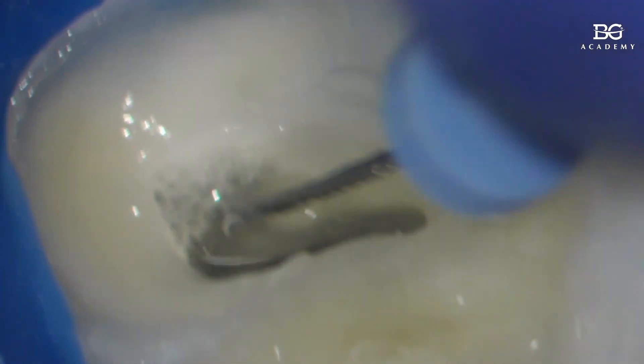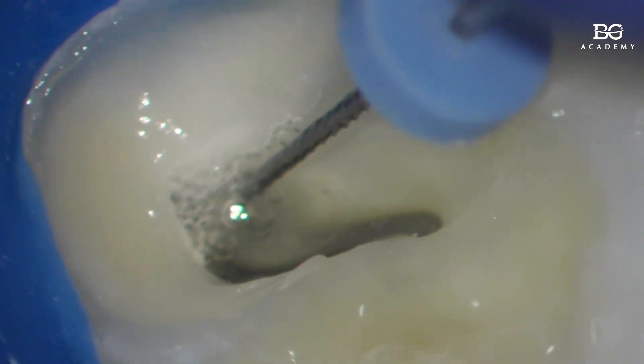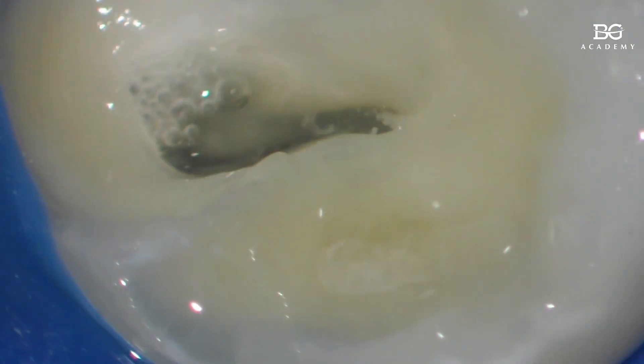Even if it's a size 10 or 8, it doesn't matter. A standard file has a 2% taper, meaning the diameter increases by 2% from the tip to the handle. So if it's a size 10, after one millimeter it's already a size 12, and after another millimeter it's already a size 14. Right there — we've gone through it. So what's the next step?